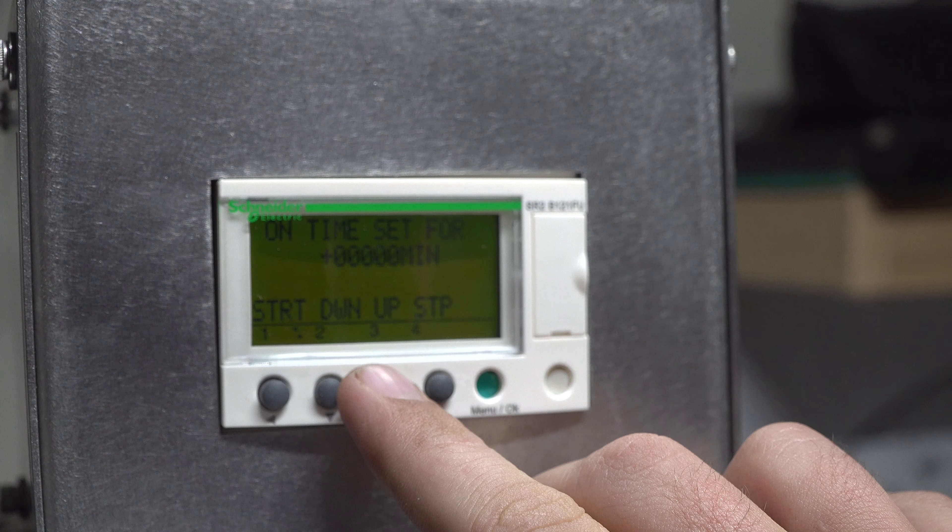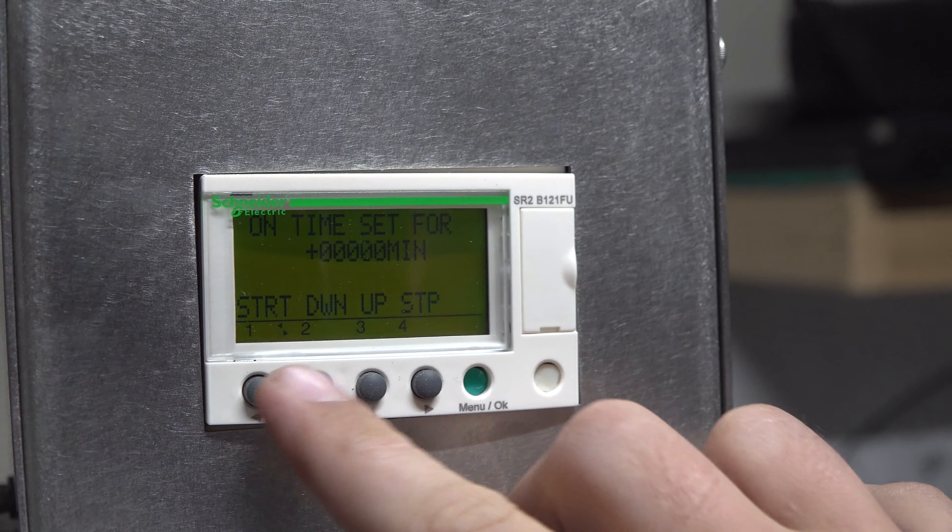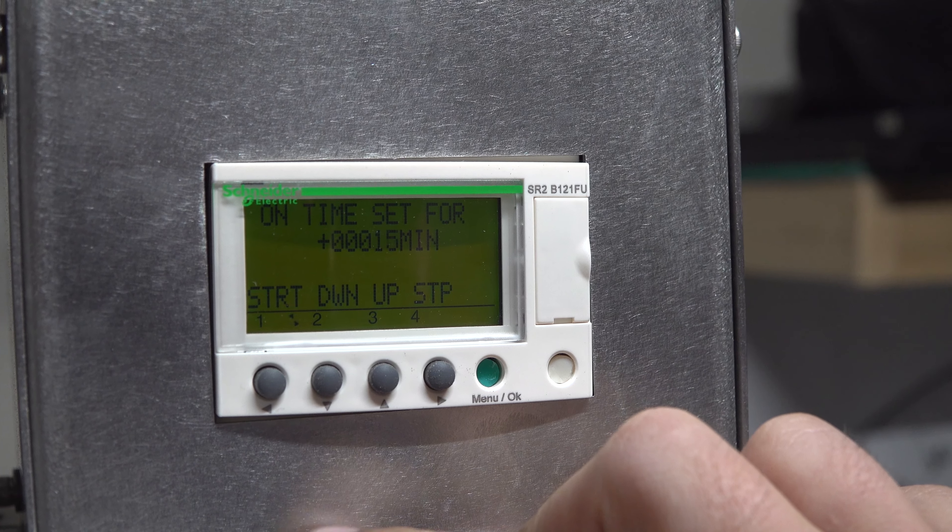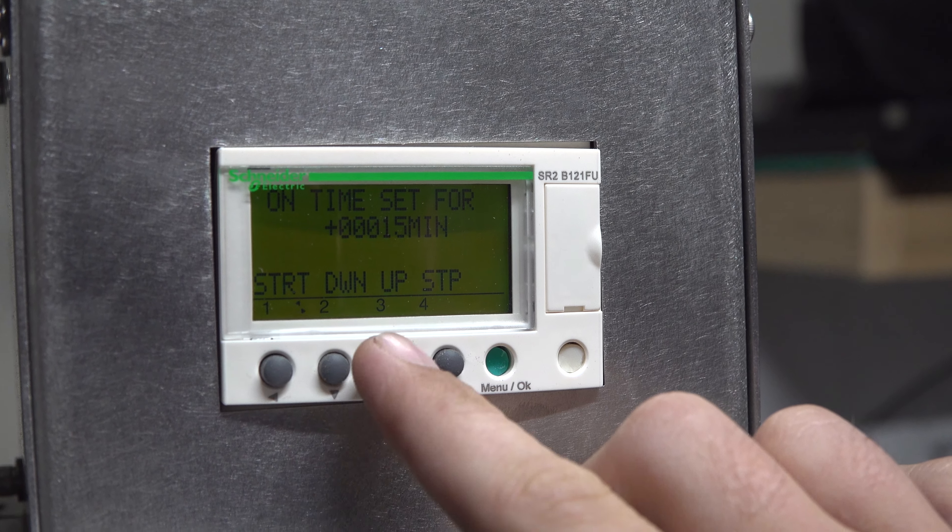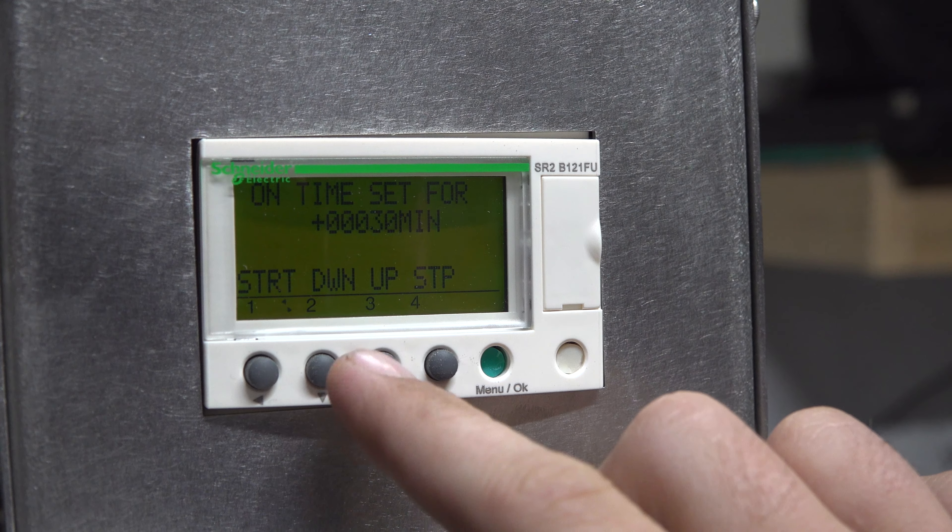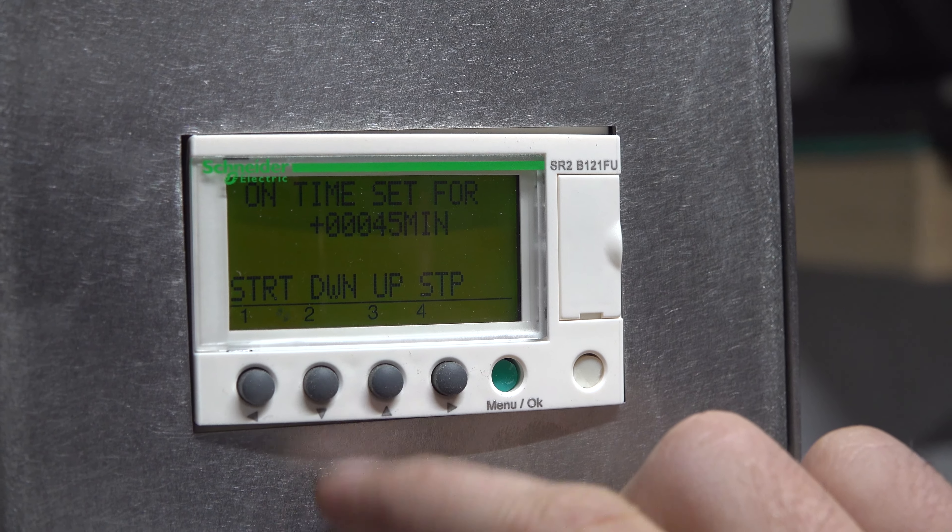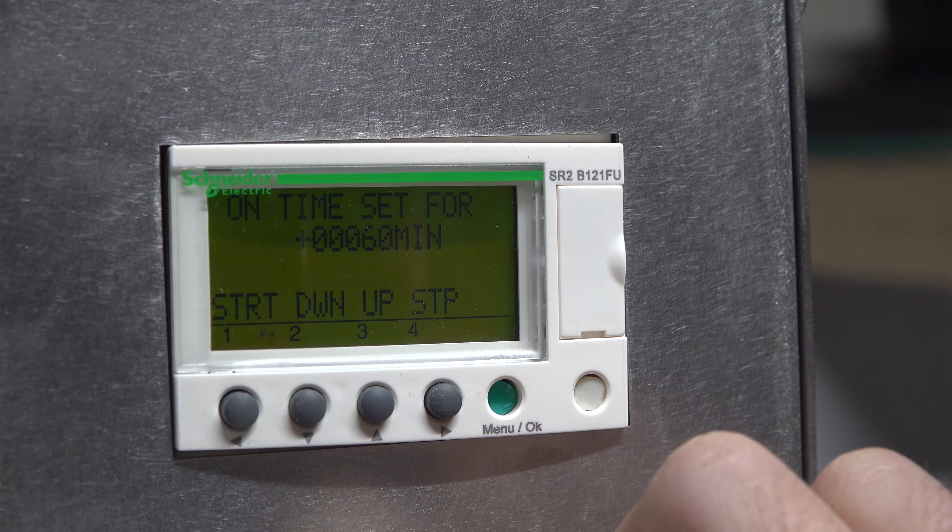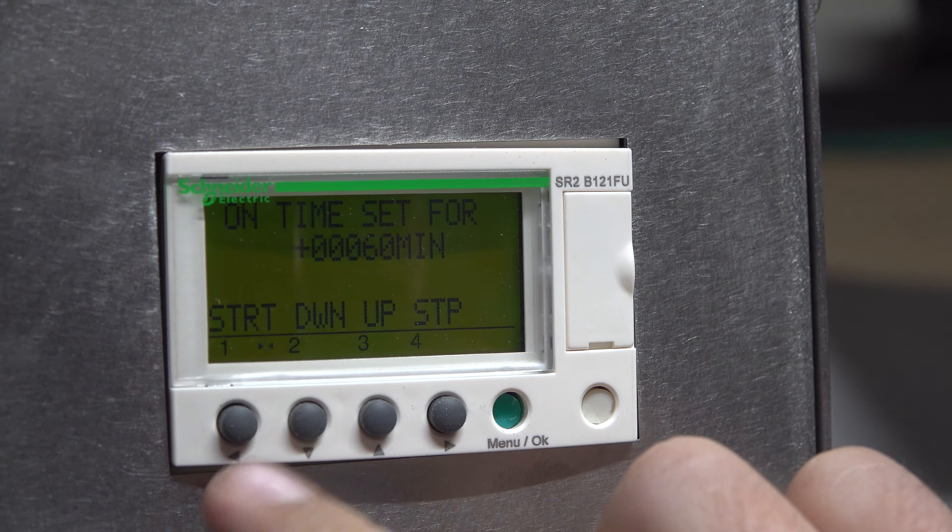The default program moves up in increments of 15 minutes. You can go as high as you want with the time.